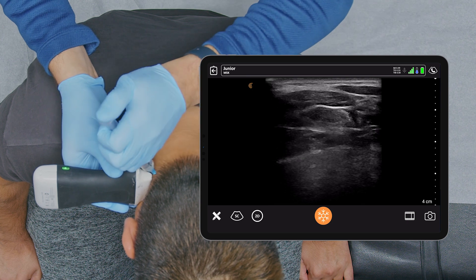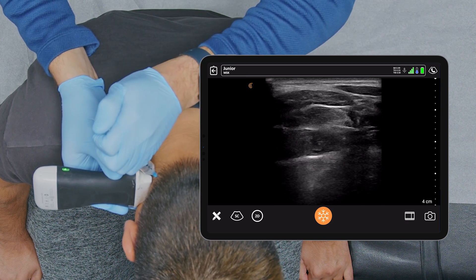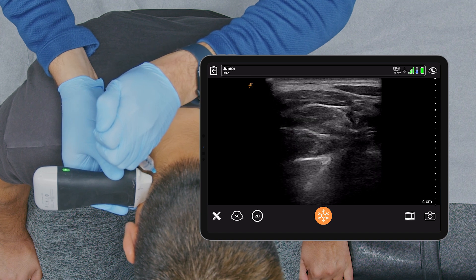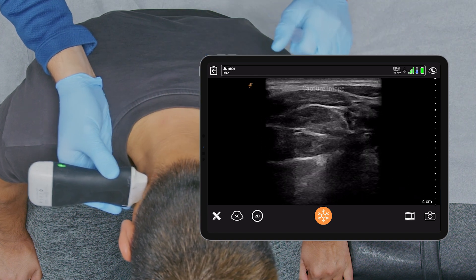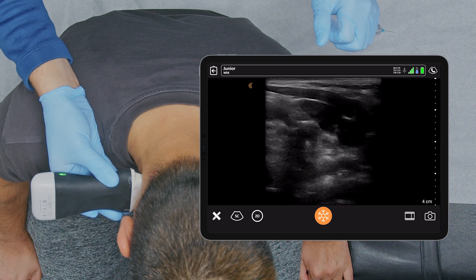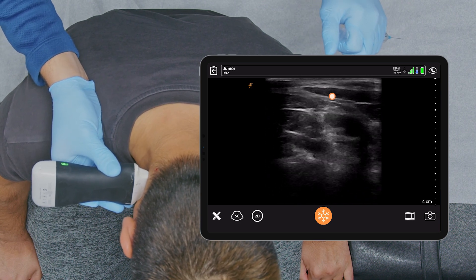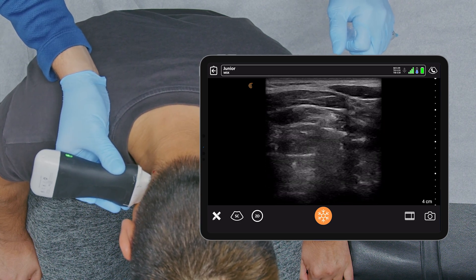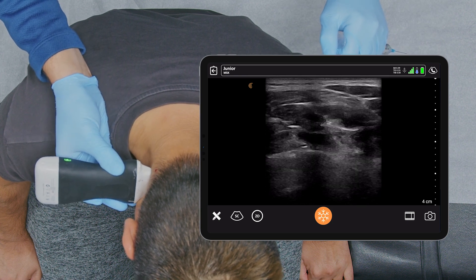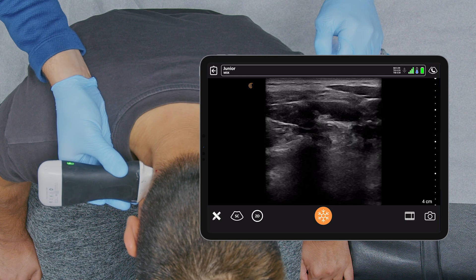Negative aspiration. Taking a look here at the sternocleidomastoid. As you can see, the lesser occipital nerve comes up from the plexus, which I'll try to target right now.